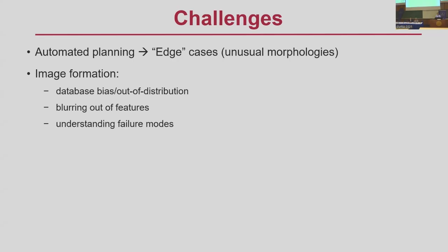We want to understand failure modes, the hallucinations that people talked about. The output looks reasonably good, so how can we conclude that something failed? The other thing is, data sharing is becoming more of a problem with regulatory guidelines from institutions. For image analysis, again, the edge cases are the problem here too.